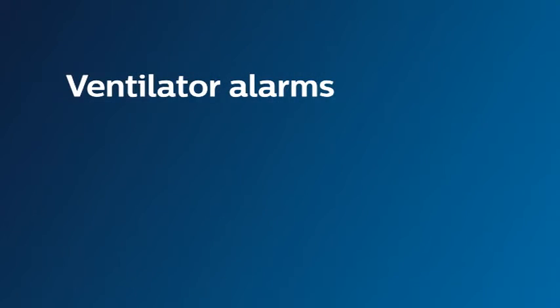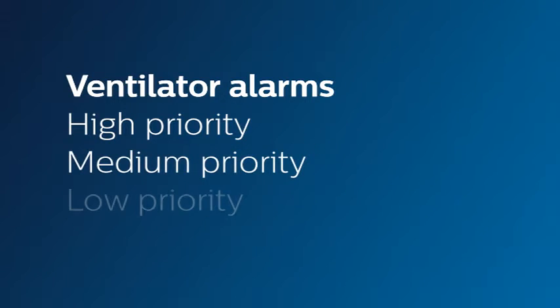The ventilator has 3 types of alarms: high priority, medium priority, and low priority. The sound and visual cues help you recognize the urgency. In addition, informational messages and confirmation alerts notify you of conditions that may require attention, but are not alarms. High priority alarms sound like this.